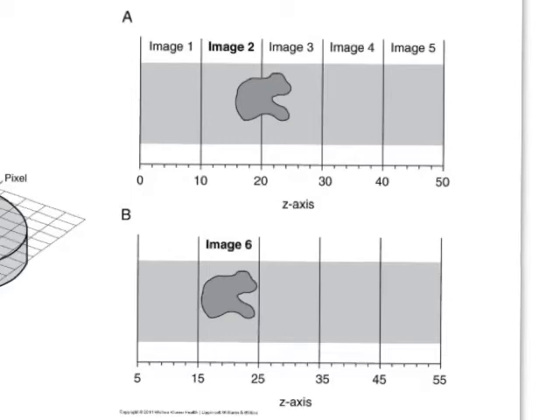All right, volume averaging. This occurs when an object straddles these slices, right? So I have this squirrel that I've CT'd or something, I don't know. But I've got it in between my slices, and I don't like that because now I can only assign one Hounsfield unit to this slice and one Hounsfield unit to that slice. So guess what? I never really got a good measure of the squirrel. I got half the squirrel in one Hounsfield unit and half the squirrel in another Hounsfield unit. And so I'll call that volume averaging.